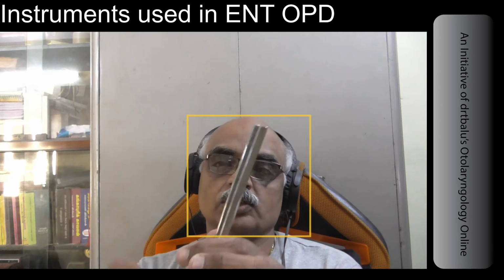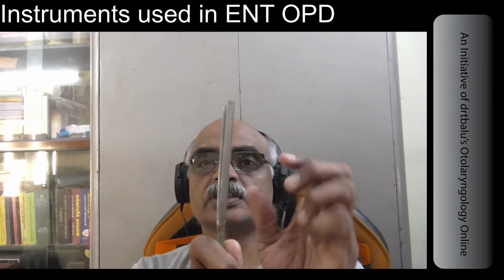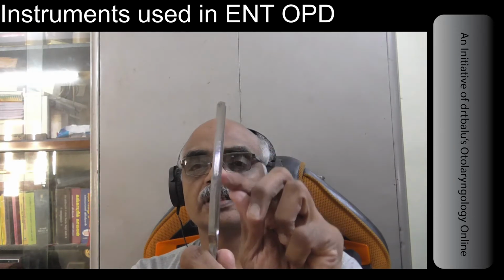Ideally, you should strike the tuning fork at the junction of the upper third and the lower two-thirds. That is the maximum vibrating portion of the tuning fork. So you hit it against the elbow, and you use the vibrating fork to perform Rinne's test, Weber's test, and absolute bone conduction test.